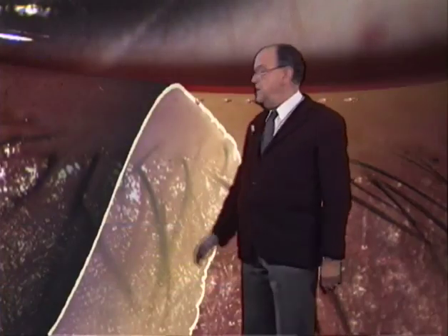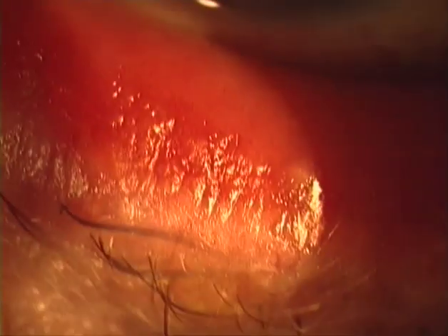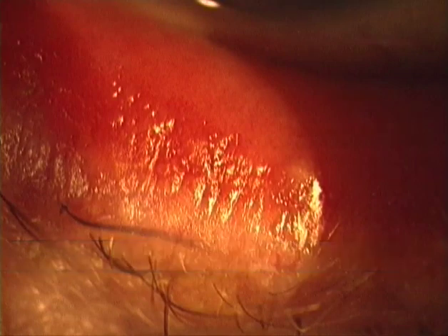Conditions affecting the cutaneous part are related to either atrophy or hypertrophy of the skin tissue. Pathology of the cutaneous part may impair the function of the various glands at the lid margin and thus affect the lubrication of the eye. Important changes involving both the epithelial and the subepithelial layer are easy to recognize, such as those due to chronic exposure, in this case of inveterate ectropion here. The detection of alterations confined to the epithelium alone, however, requires a judicious use of the special illumination techniques.